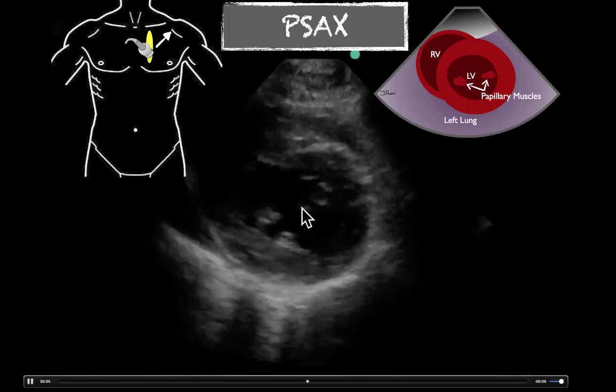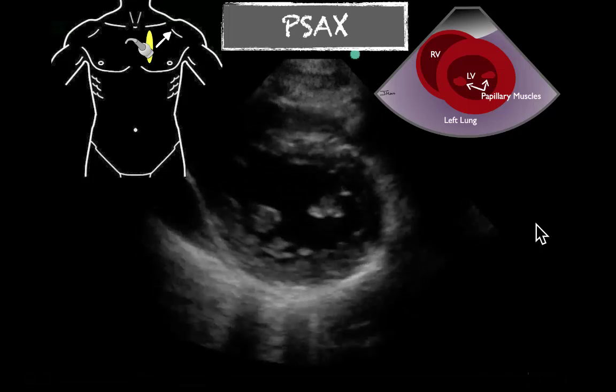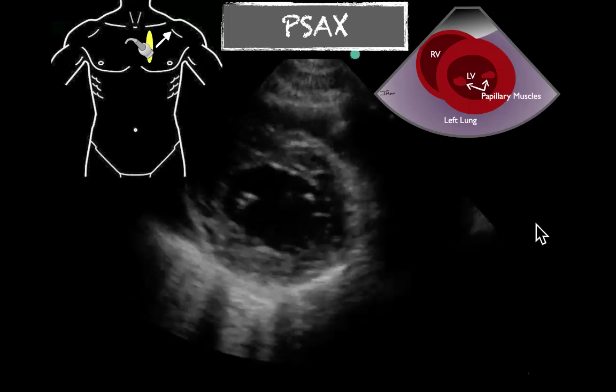Things we could do with this image is move it to the center, which we see right here at the end of the video a little bit, and that would help us to ascertain that a little bit better. Hopefully that helps to give you some examples.